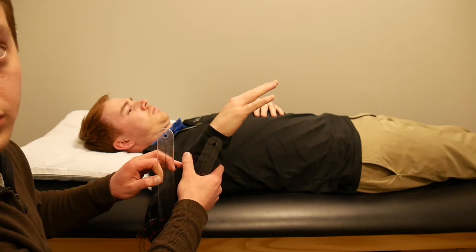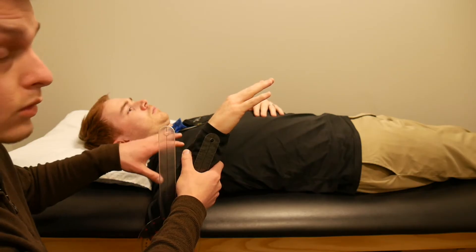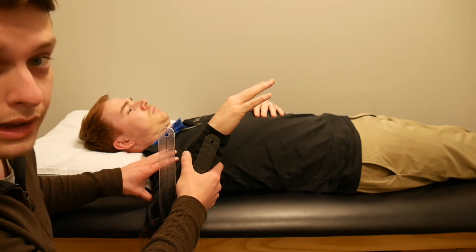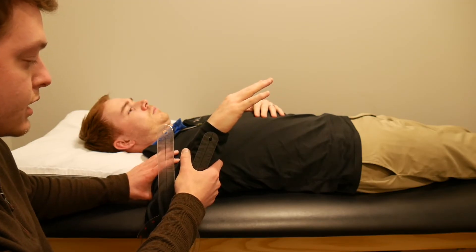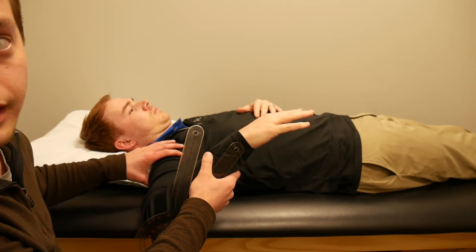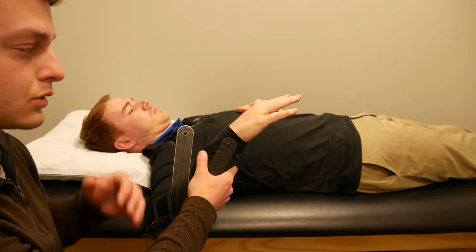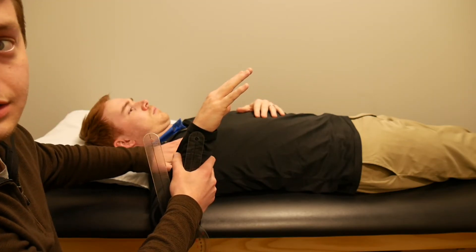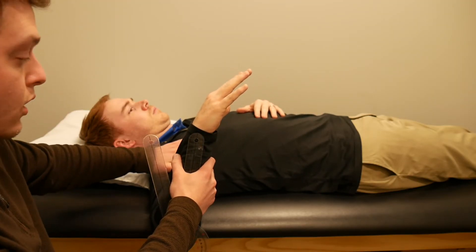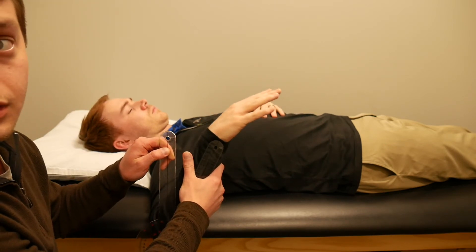One thing to mention with internal rotation is that some patients don't have a lot of it, and you may see them compensate by lifting their shoulder off the mat — which looks like a lot of internal rotation but isn't actual internal rotation. To prevent this, ensure their shoulder stays down by holding it with your other hand or verbally cueing the patient to keep their shoulder down as they move into internal rotation.